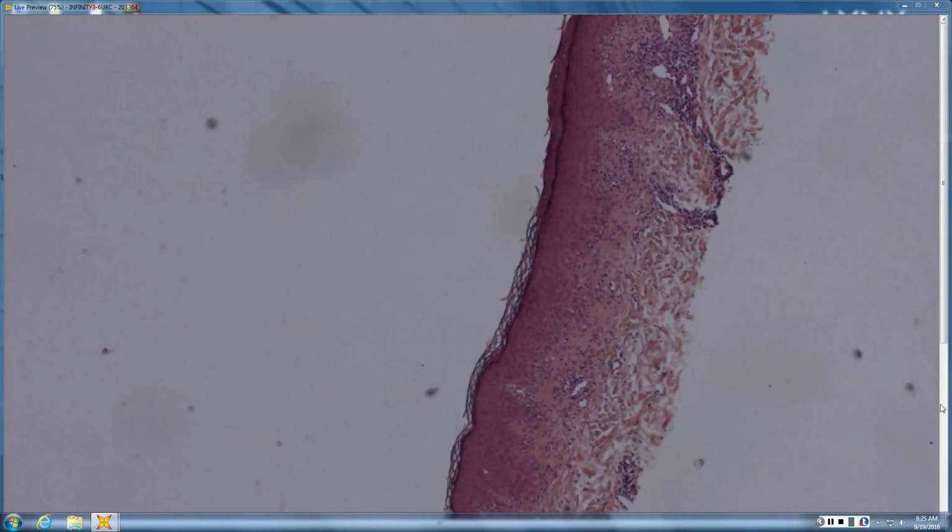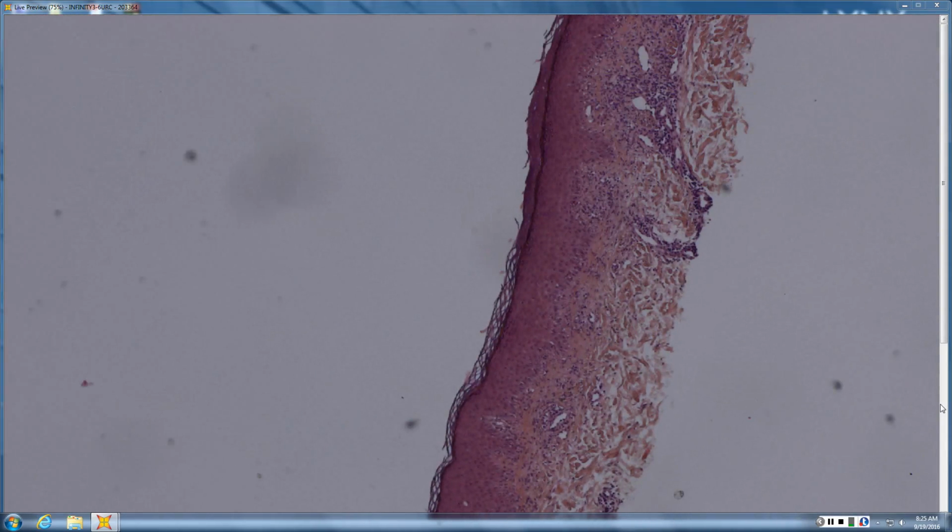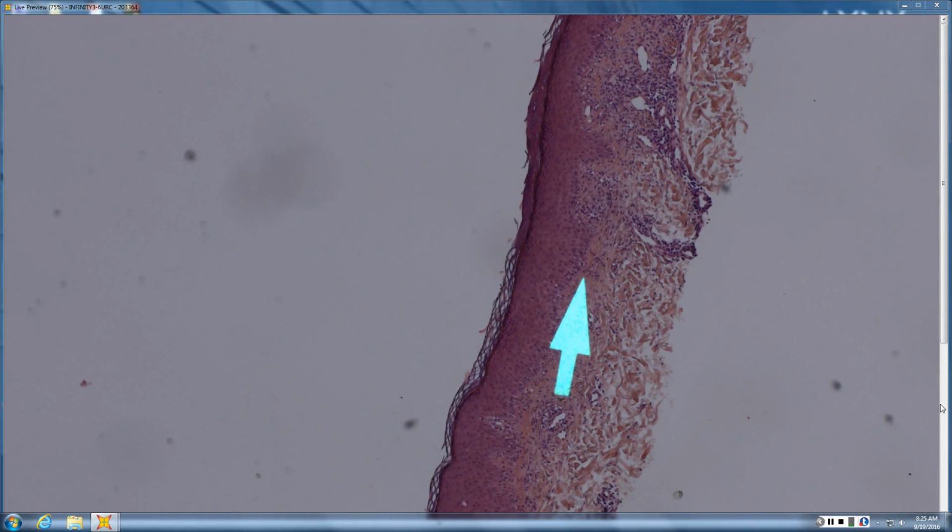So most of the stratum corneum is basket weave. Some areas have compact orthokeratosis. So if some areas are a little more compact, most of it basket weave, so maybe hints at BLK, depending on history. There's some fibrosis there. There's a lot of fibrosis. You can see real ropes in there, right? And how about the pigment? It's pretty deep. Pretty deep, so what do you think? Fixed drug. Fixed drug, very good.